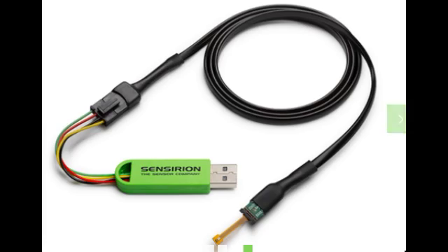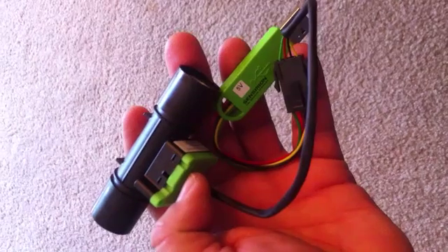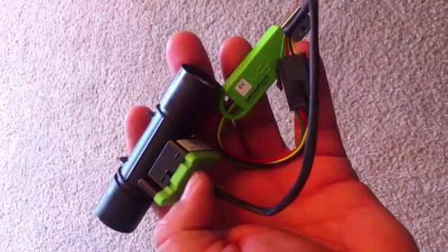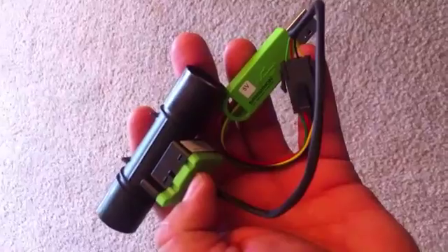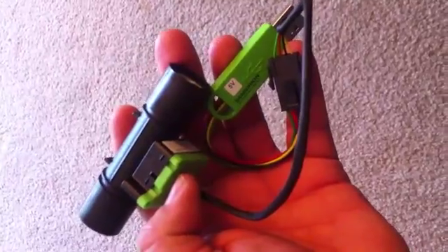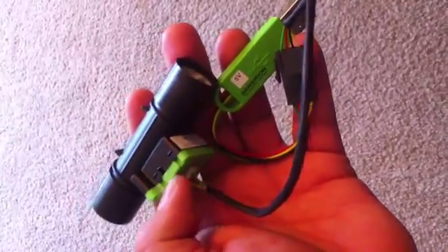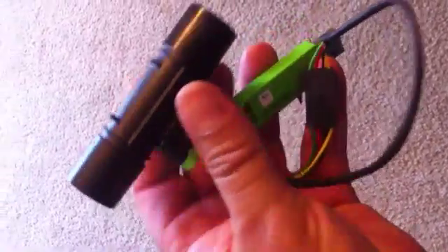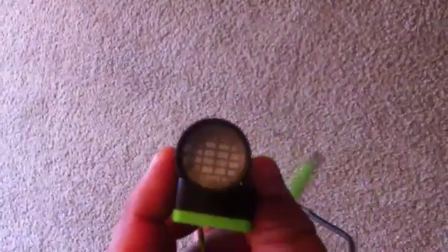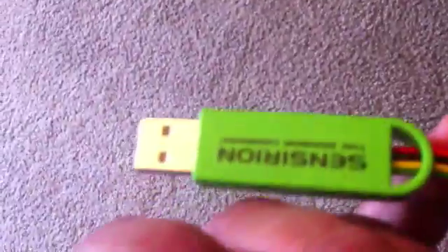Now let's test the sensor. We have this part here, which is the sensor, and this part, which is an interface to convert from I2C to USB.